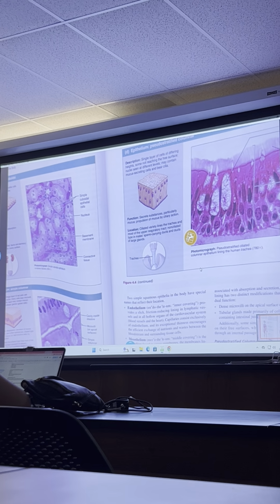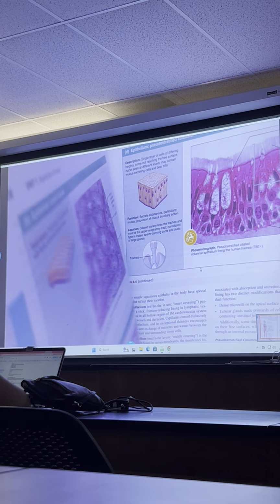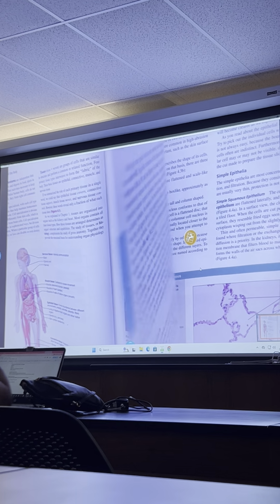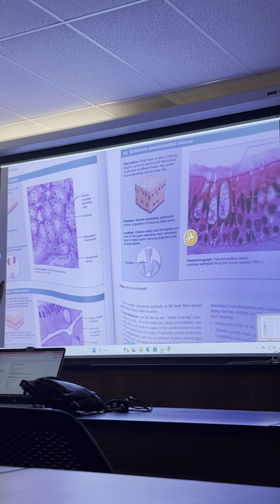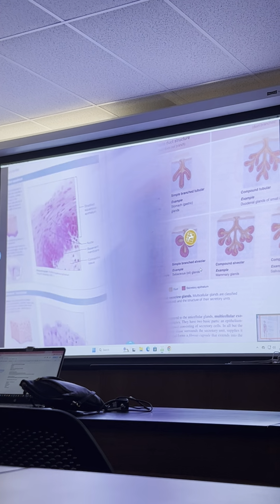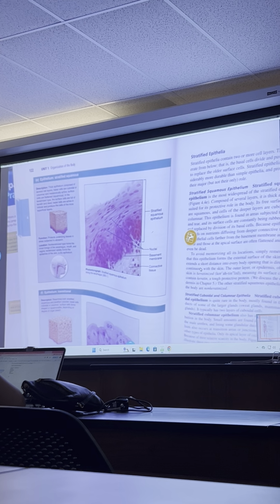There's more stuff here, hopefully we'll get back to it. But I wanted to show you those. So now you've seen the different kinds of tissues, mostly. Oh, no, we skipped one. We got another one here. So, there we go, this is page 122. Okay, what do you think about this?